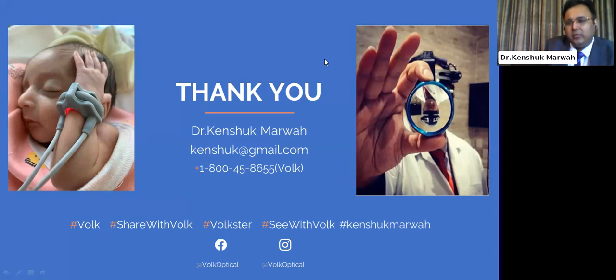But at the end of the day, because I'm a retina specialist, I would do my indentation and a 360 double check. That is my personal preference. But if you are not comfortable with the BIO, then you go for a pan retinal lens or a super wide field lens. That would be good, but it all requires a little practice.